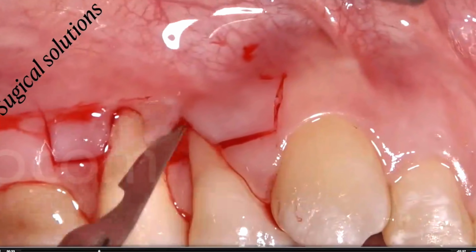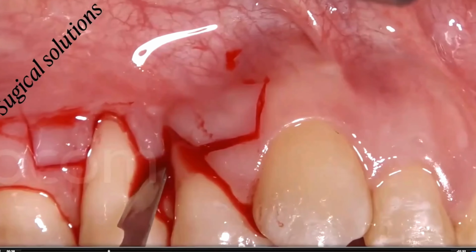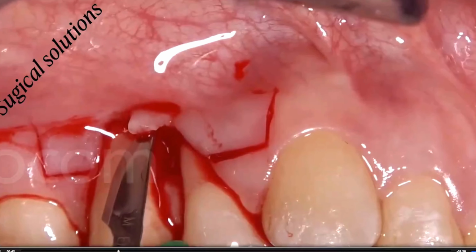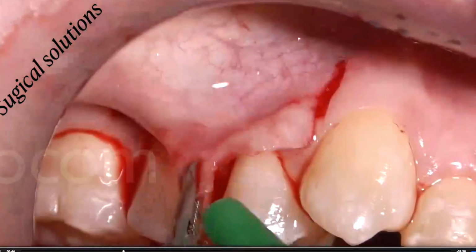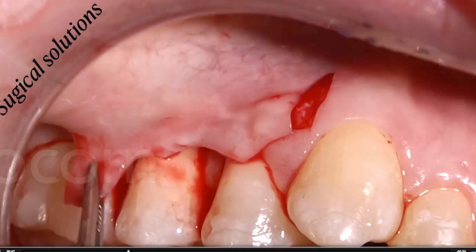So this is the papilla elevation in this particular case, which is an exception because of the very big avascular surface. Now, what you need is a flap that is so free to be advanced coronally that this papilla is so free to join with the anatomic disepithelialized papilla without any tension. And this will be the last one, obviously, to be stabilized once the adjacent papillae have already stabilized the flap in the coronal position.